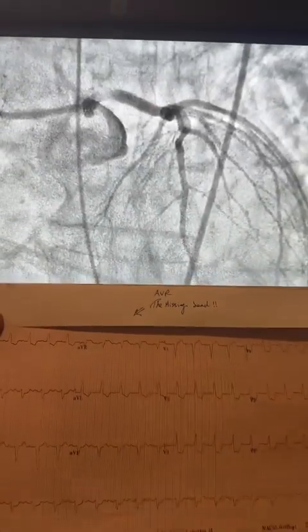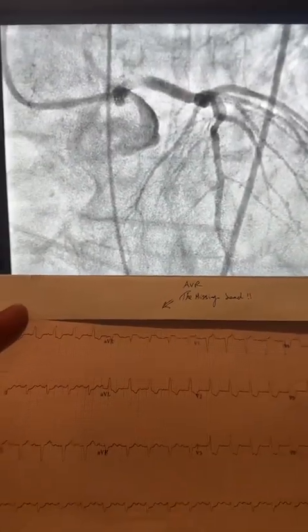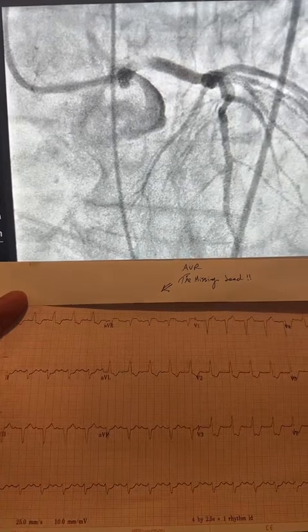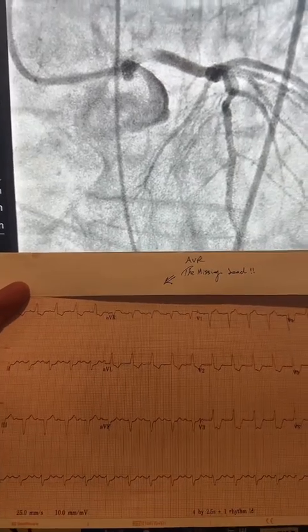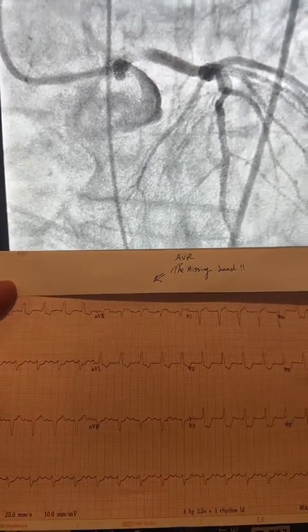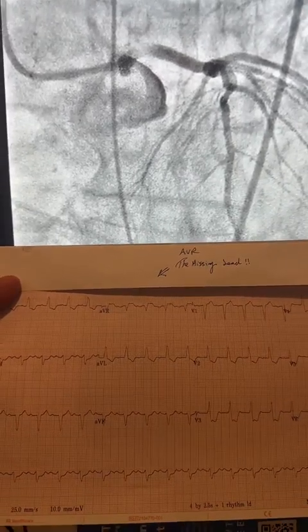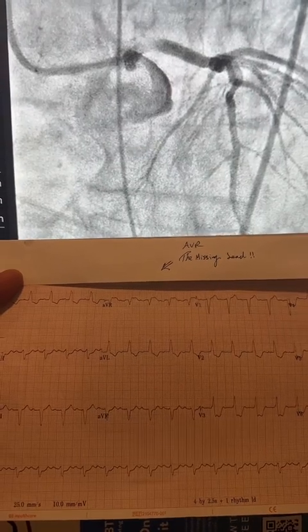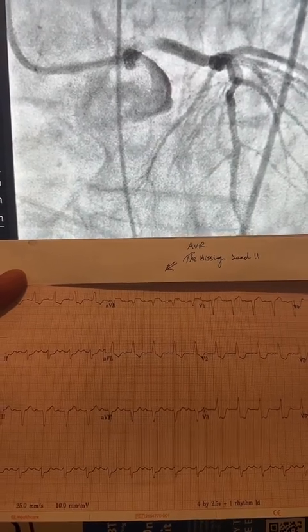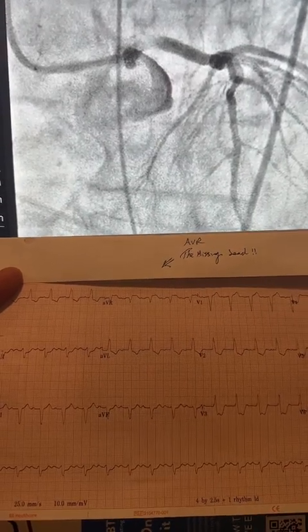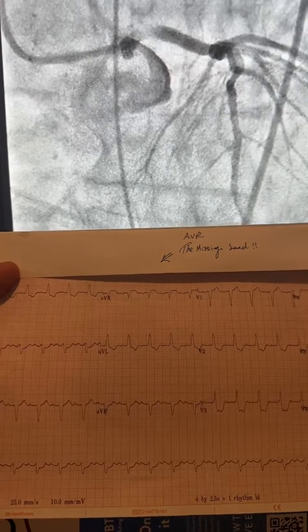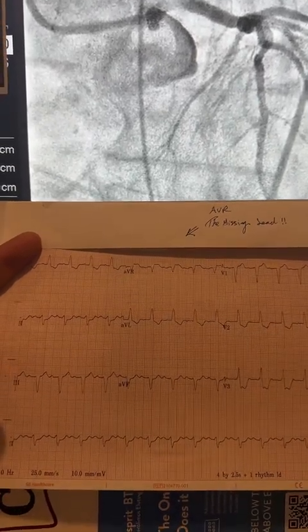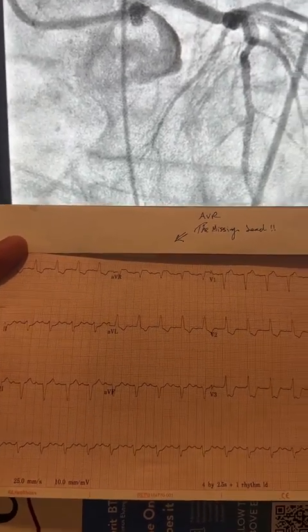Good evening. Let me share with you this acute case I just finished. Patient is 82 years old, presented with respiratory failure, found to have acute non-ST elevation MI, elevated troponin, and here is the EKG.